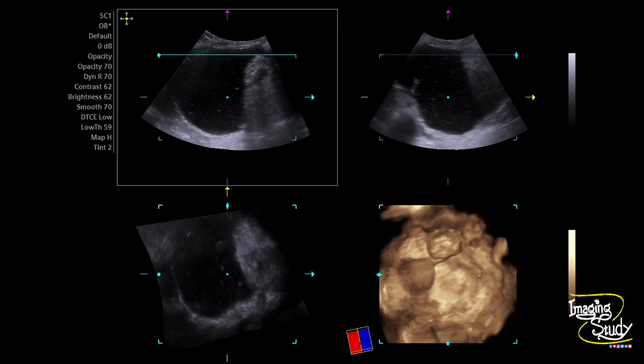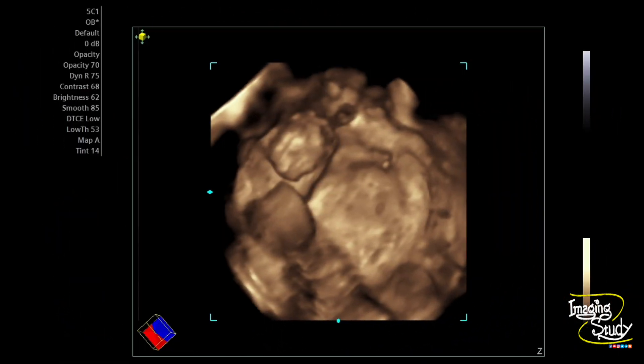Since we found fat balls within, we took a 3D ultrasound — note this is not a 3D transducer, it is a regular convex transducer moved manually to acquire a 3D image, so picture quality may not be as good as from a dedicated 3D transducer. After magnifying the image, you can see ball-like structures within — these are the Pokemon balls — and some areas may represent calcified structures like teeth.